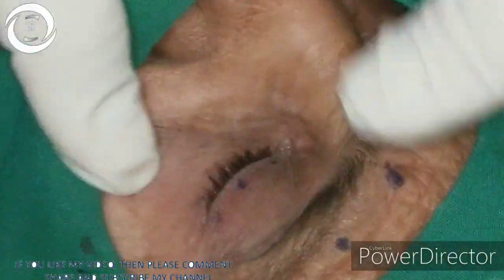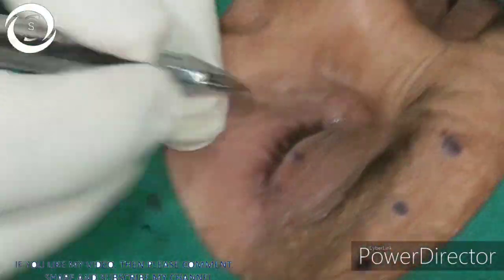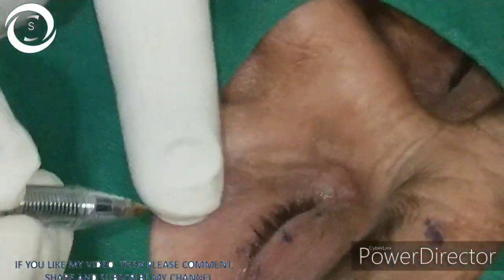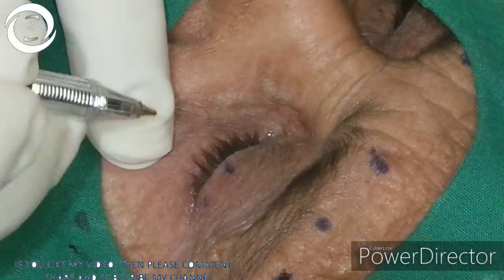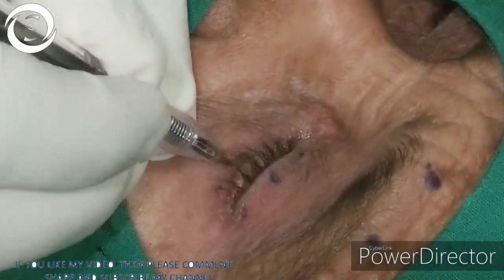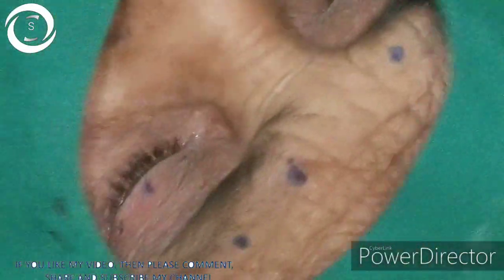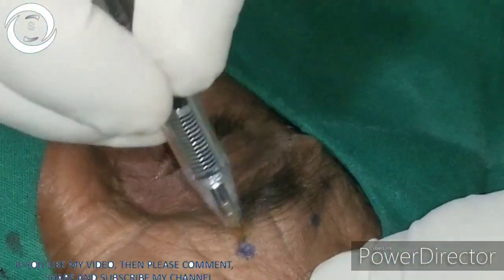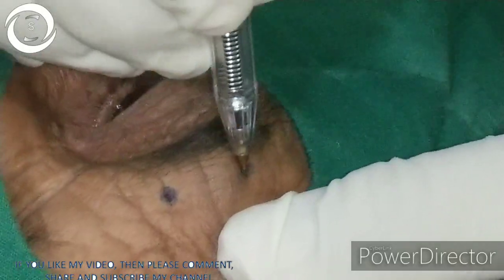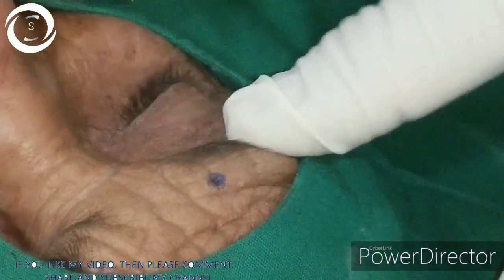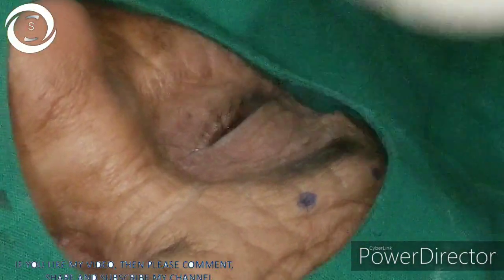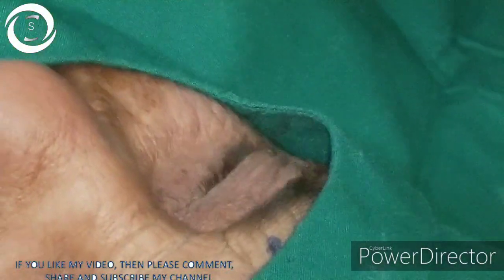Mark the pretarsal upper eyelid orbicularis at three points. The central point is just in relation to the center of the pupil. The medial point is just above the superior punctum, and the lateral point is in relation to the lateral canthus, two to three millimeters from the eyelid margin.